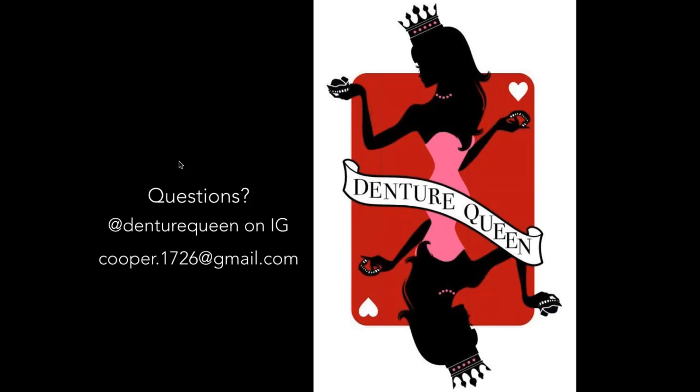From those maxillary and mandibular impressions, the lab takes all of the known anatomical landmarks, from the incisive papilla, hamular notches, etc., and is able to digitally articulate those maxillary and mandibular casts in a preliminary articulation, and then they set teeth in a wax type material based on that, so that you then have a preliminary tooth setup that is based on anatomical references. So if that's a system that you like and find helpful, I would suggest trying the Wagner Try-In because it does incorporate a lot of those things.